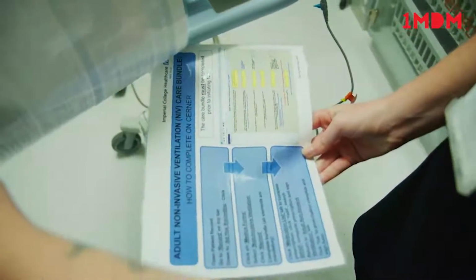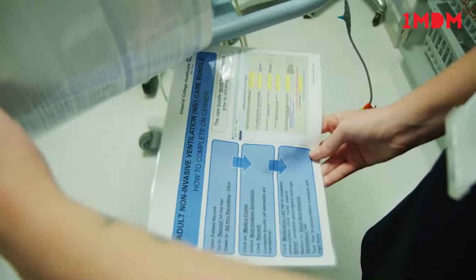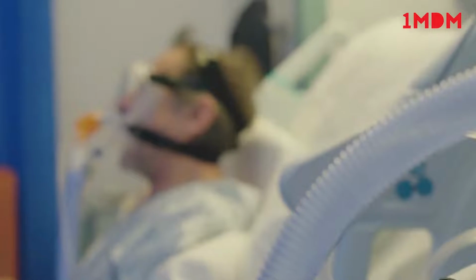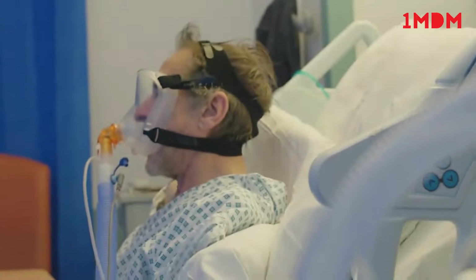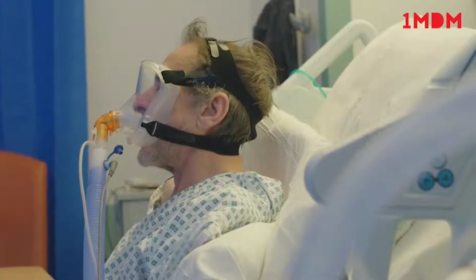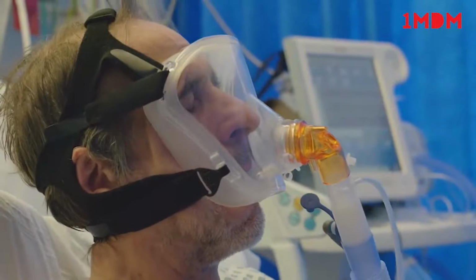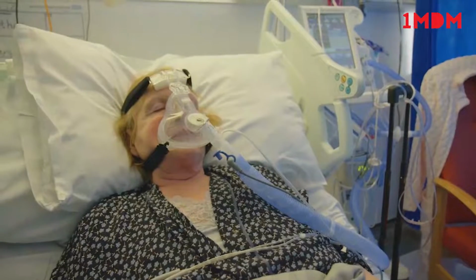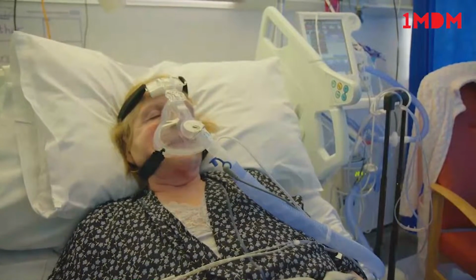The NIV algorithm is there to help guide you through this early treatment of a patient in type 2 respiratory failure requiring NIV. Now your patient is on NIV, ensure you regularly check their pressure areas, particularly around the mask. Ensure they receive physio and refer to any other specialities as required, including dietitian or speech and language therapy. Staff looking after patients on NIV should ensure that they receive regular training and complete their NIV competencies.